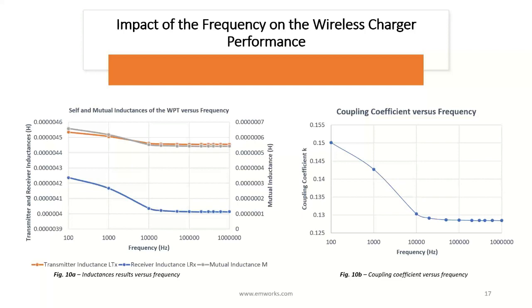Now let's move to see the impact of the frequency on the wireless charger performance. The frequency has several effects on the wireless charger system. A frequency sweep analysis is performed using EMS for SOLIDWORKS to study the different aspects of this impact on the wireless charger. Figure 10b shows the coupling coefficient, which is decreasing with the frequency. So we may expect that the induced voltage will also decrease. We will find out in the next slide.